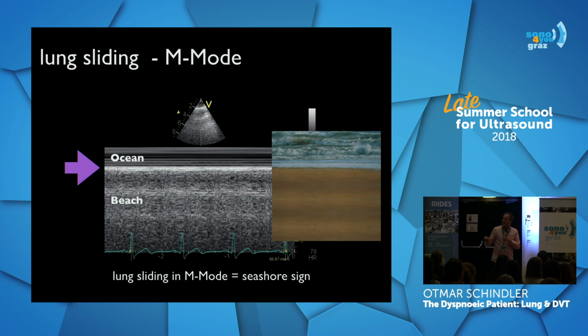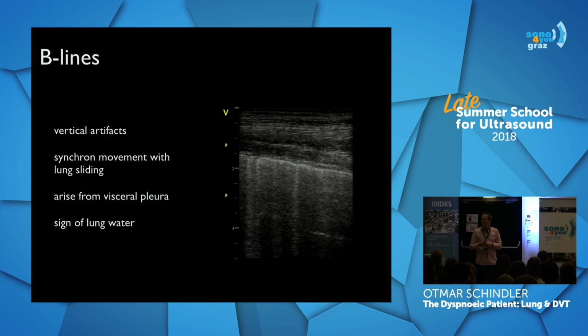So the important thing is you have a change here where the pleural line is. Outside the pleural line, nothing is moving in M mode, yeah? Because the thoracic wall is not moving normally. And behind the pleural line, there is a motion. There is the lung artifacts, in fact. It's not the lung that you're seeing, and that's moving, so you have a moving picture there.